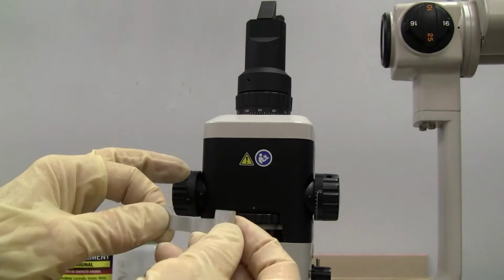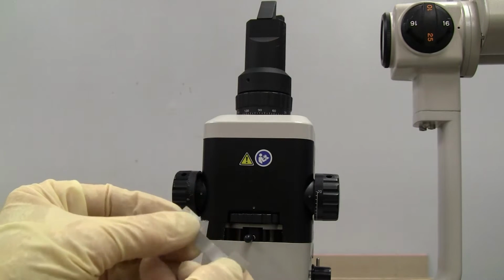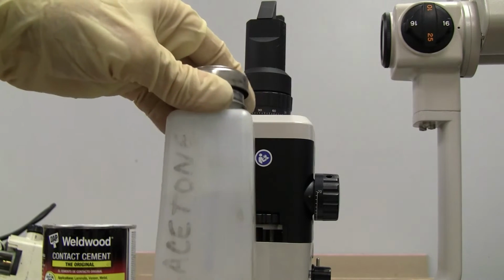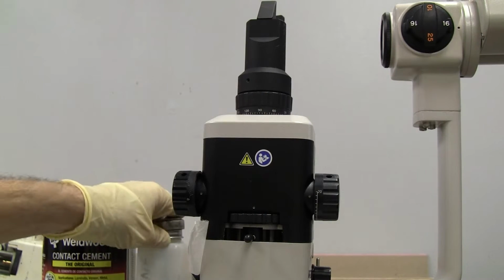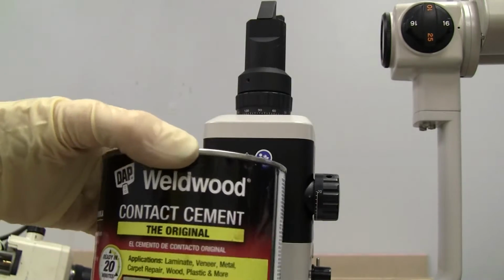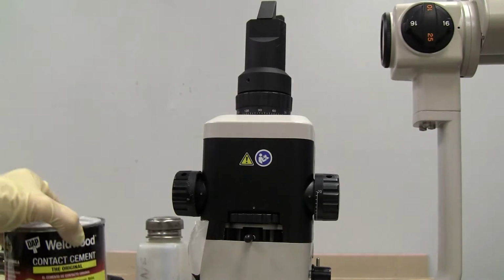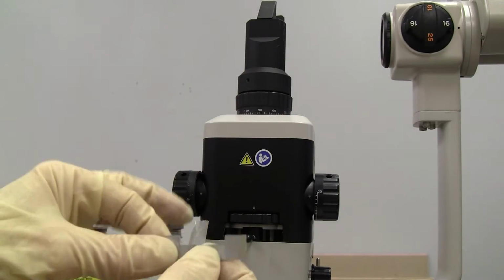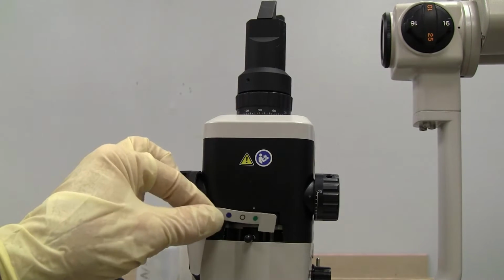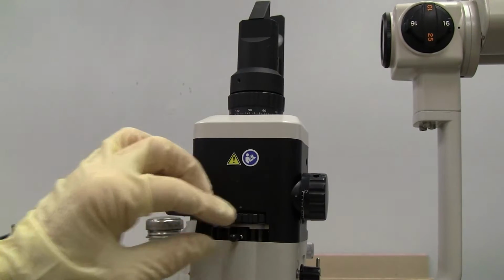So what I'm going to do is I'm going to clean this old glue off with some acetone, and then I'm going to apply just a little dab of cement, whatever you have available. So we're going to do that, and then we'll concentrate on adjusting the alignment of the lever.